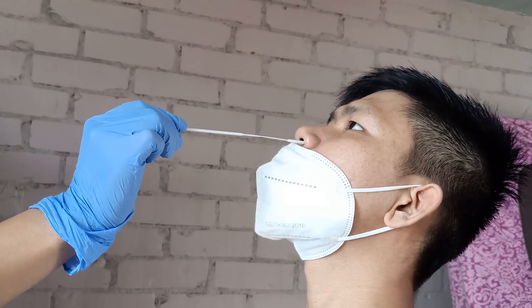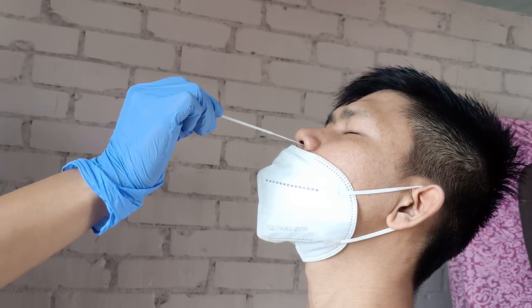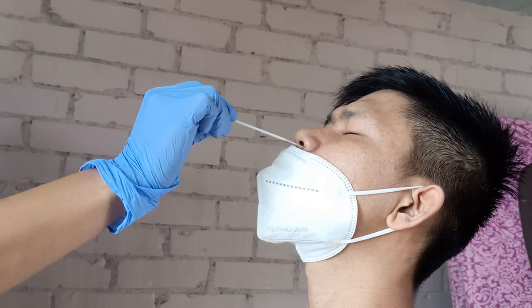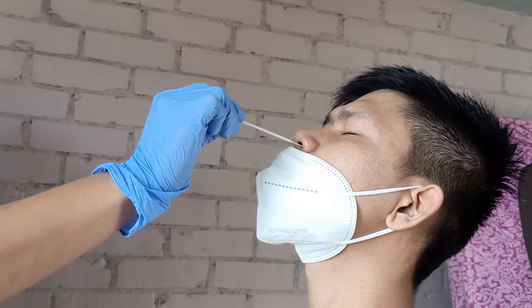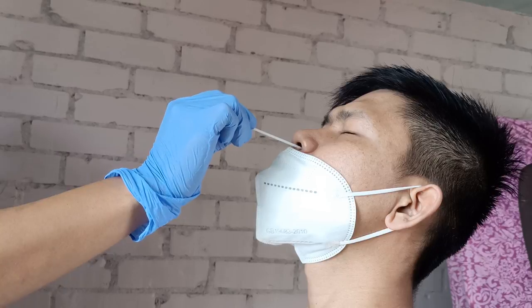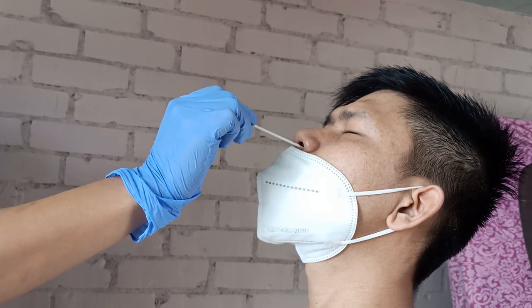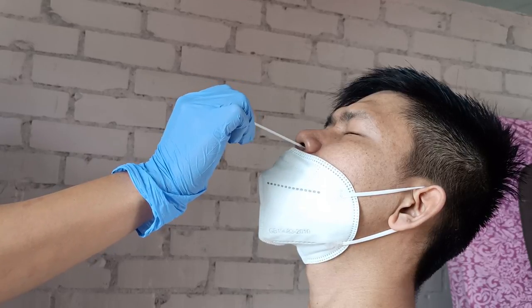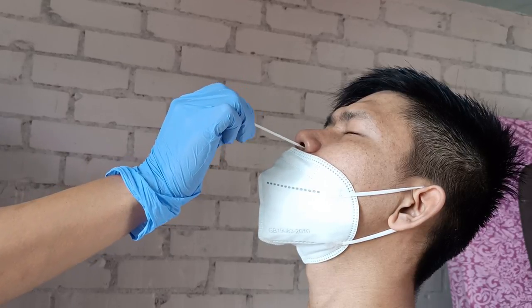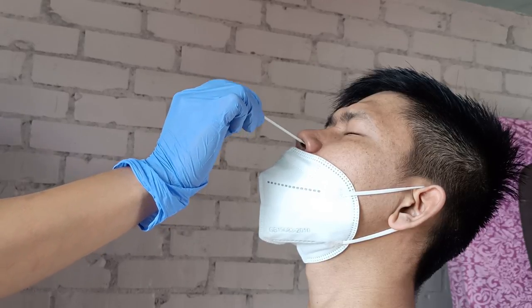Now holding the nasal swab stick handle with the thumb and index finger, insert it carefully through one of the nostrils of the patient and into the nasopharyngeal region of the nasal cavity. Once the cotton tip of the swab stick reaches the very end of the nasopharyngeal, carefully rotate the stick in a semi-circular motion repeatedly — clockwise then anti-clockwise — for about 5 times, then gently but quickly remove the swab stick from the nasal cavity entirely.